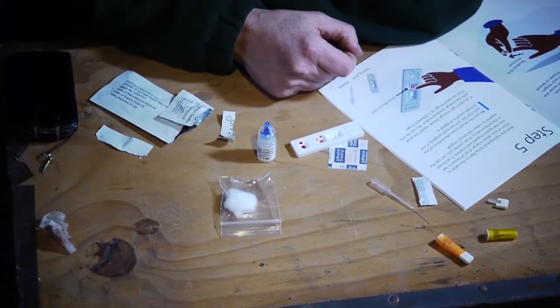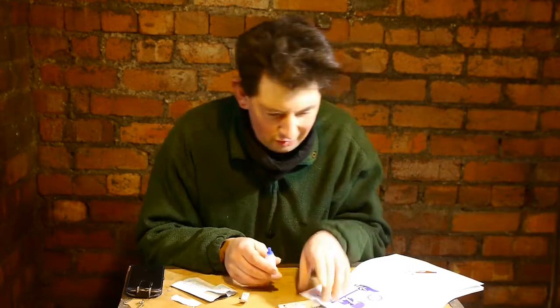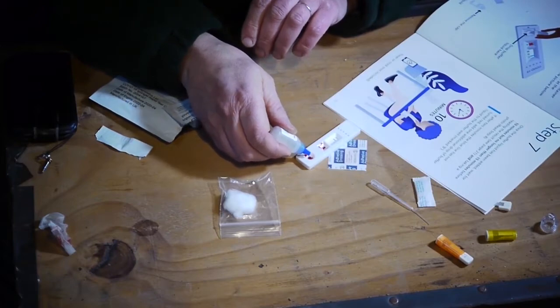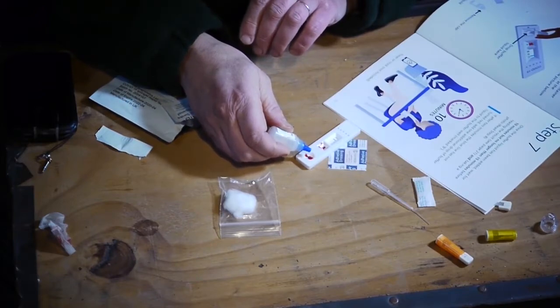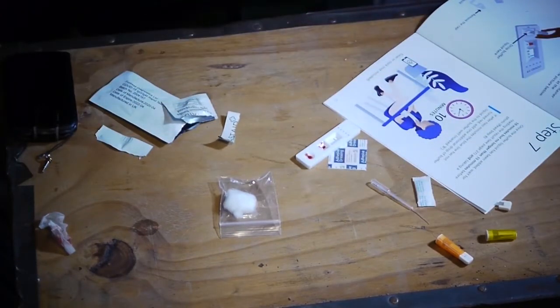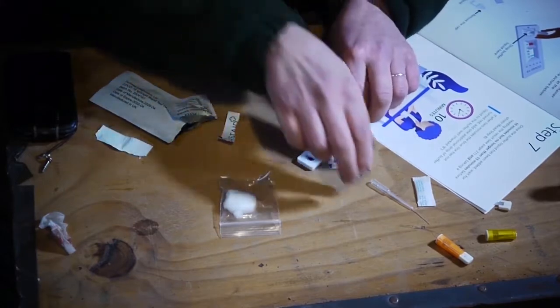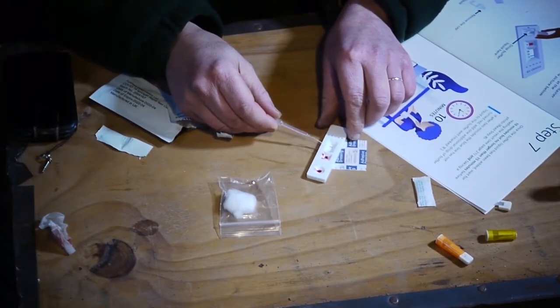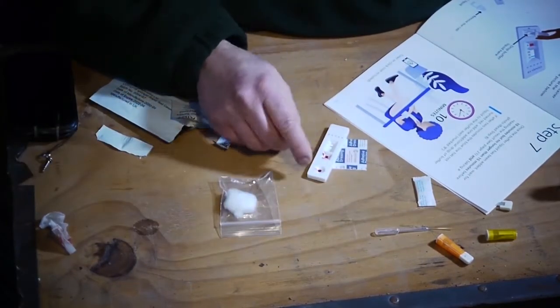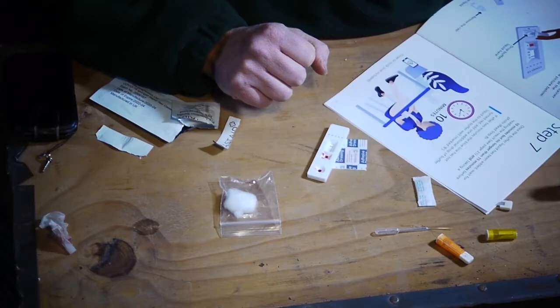Okay, so I've got this, remove the stopper, add 2 drops to the circular well where I've already put blood, which I shouldn't have done. Okay, 1 drop, and 2 drops. No idea what this is going to do now. Ooh, you probably can't see this on camera, but things are starting to soak up in this little window here. I can see liquid soaking up. It could be that it works when there's blood in both places, or it might be that it doesn't. I don't know the science enough.